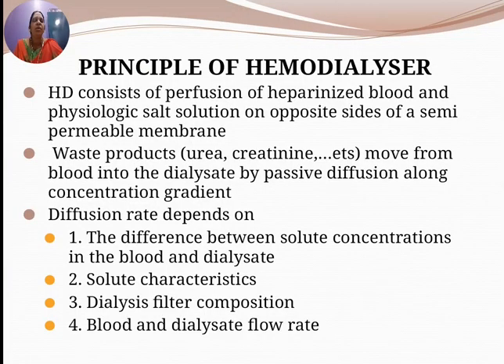So this is the principle of the hemodialyzer. HD consists of perfusion of heparinized blood and physiologic salt solution on opposite sides of the semi-permeable membrane. Waste products like urea and creatinine move from the blood into the dialysate by passive diffusion along the concentration gradient.